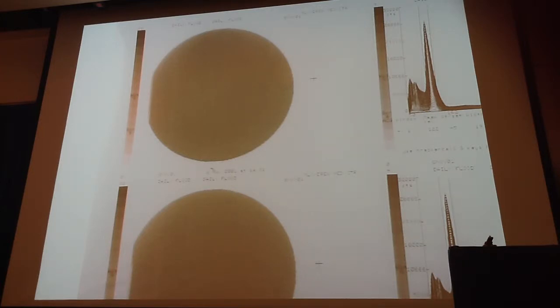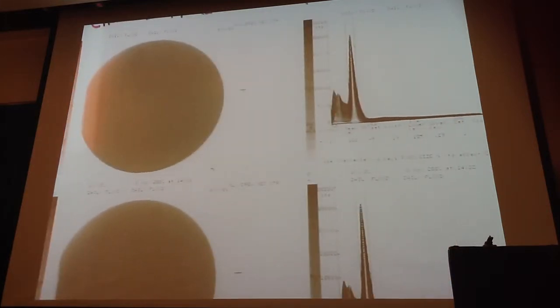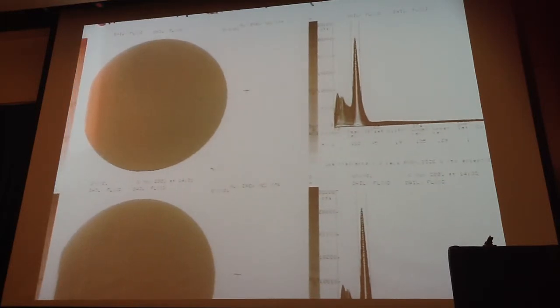So, like I said, you need to look at your spectrum. I think I showed you one of the problems that we had where one camera was peaked with cobalt and there was contamination on the detector. Did I show you that one? Actually, I think it's in here.